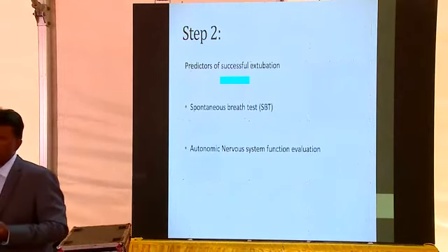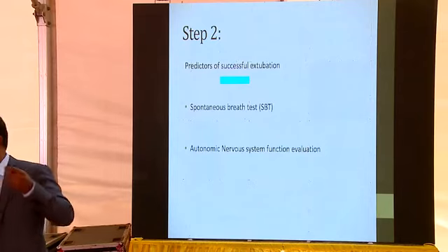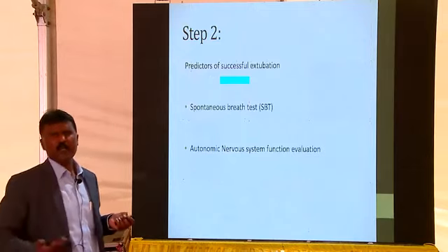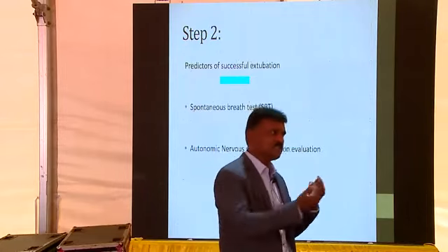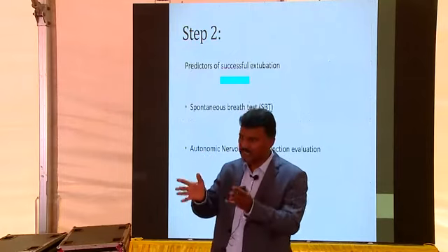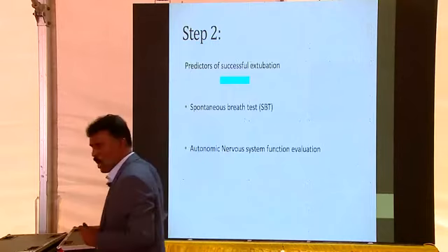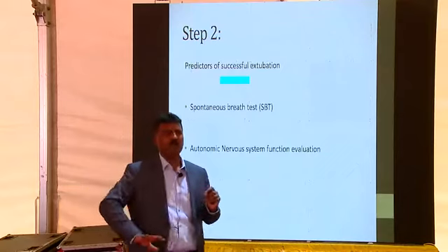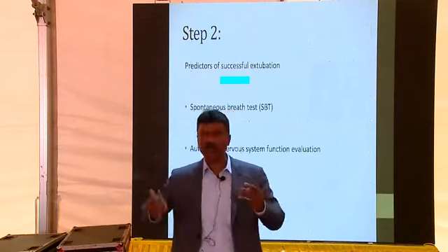but clinical prediction still holds good, yet there is still a lacuna in clinical assessment. So people want to objectively know this baby is ready for extubation. It is not a standard of care. Let us be very, very clear about it. It's not a standard of care.